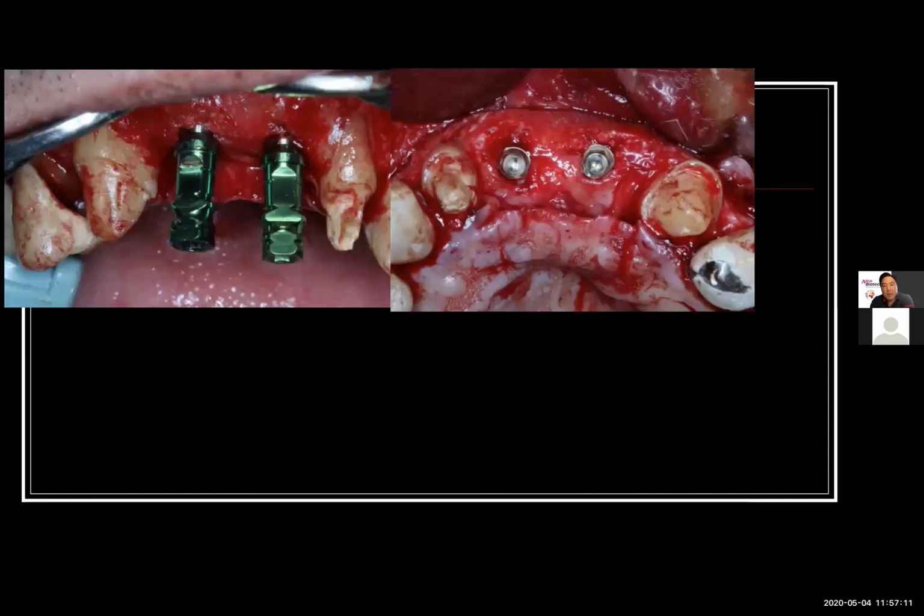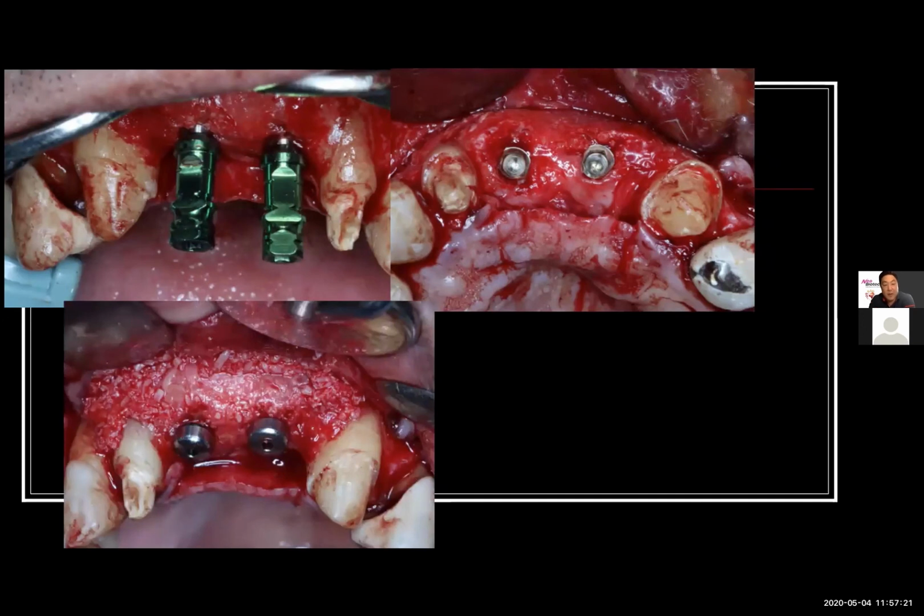And he's going to be undergoing ortho treatment as well. So that canine number 11 is going to be moved to the distal, and we're going to compensate that to make room to have a pontic there for a lateral incisor. But look at the volume, the amount of bone that we have. And so we had our fixtures in place, good primary stability.